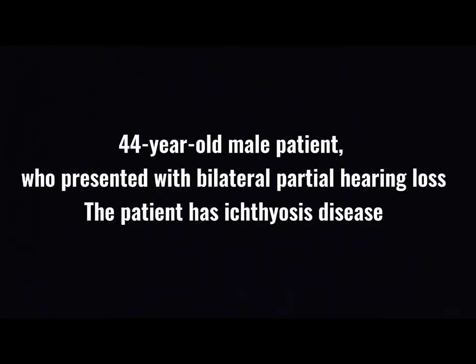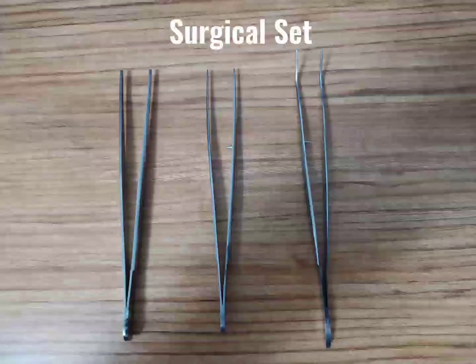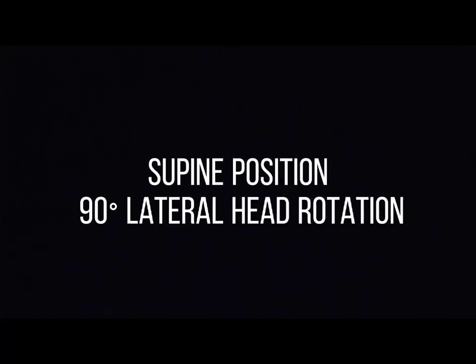A 44-year-old male patient presented with bilateral partial hearing loss. The patient had ichthyosis. We planned bilateral ear cleaning for this patient. We have a basic endoscope and a basic surgical set. Supine position with 90-degree lateral head rotation is the best choice, I think.